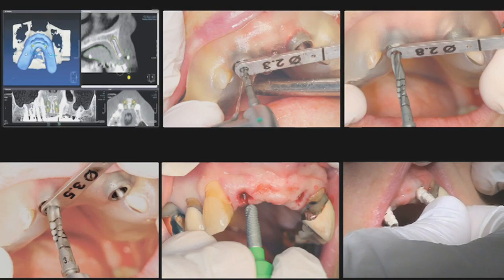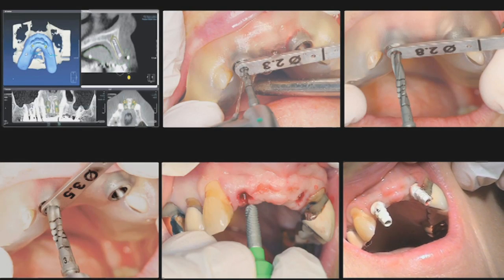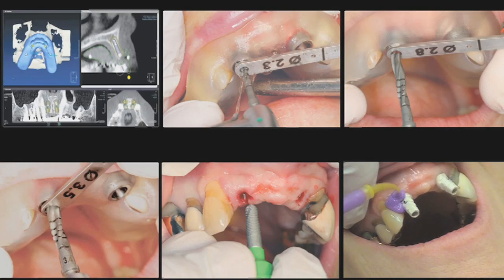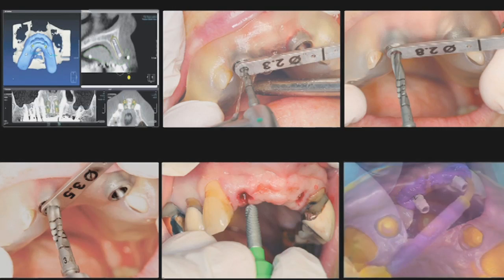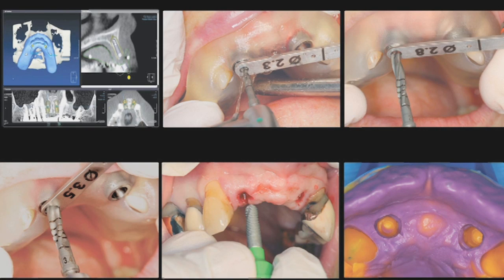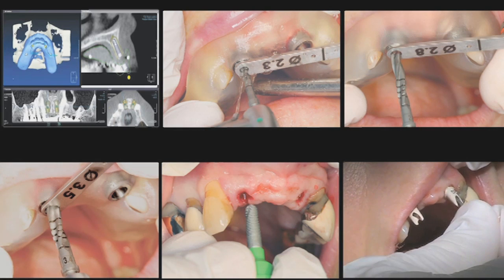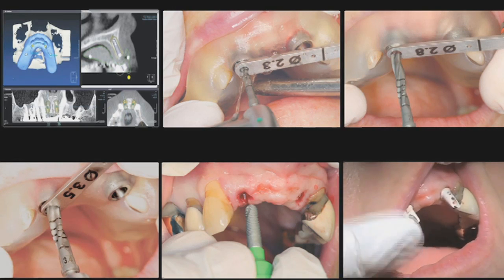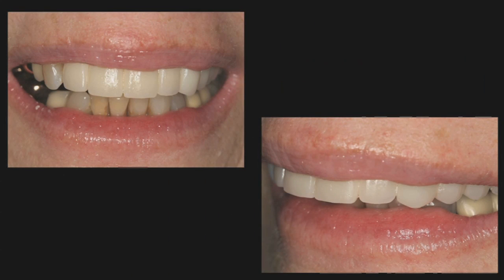Our advances in diagnostic technology and surgical protocols have made dental implant treatment substantially simpler, safer, and faster. The introduction of this inclusive tooth replacement solution takes that simplification even further. It eliminates the biggest barriers to placing implants and provides all the tools necessary to work from the very onset of treatment toward achieving the most aesthetic restoration possible. We have that obligation to provide our patients with the most innovative, proven techniques available.